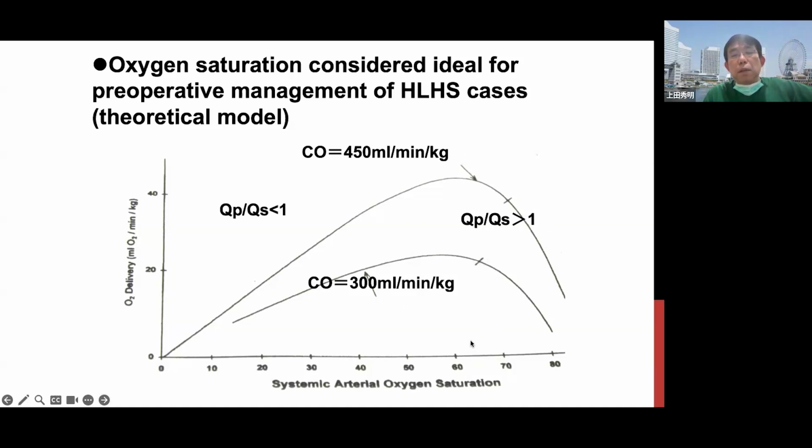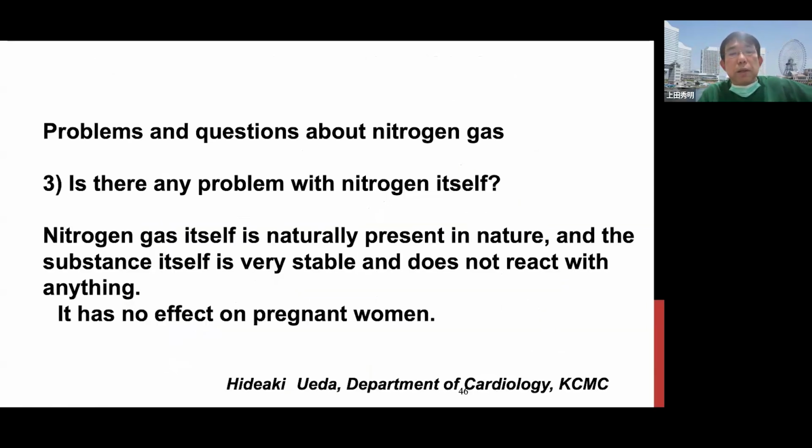But keeping the saturation this low would be very difficult, and I think we could not feel comfortable. So 70 to 80 should be enough. But please keep in mind never to put the patient above the 90s. Please use the nitrogen gas to reduce the saturations.